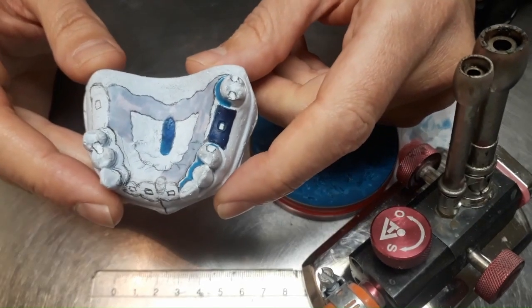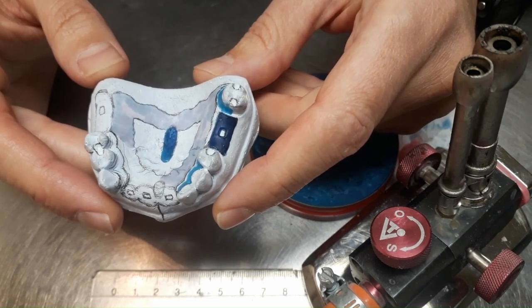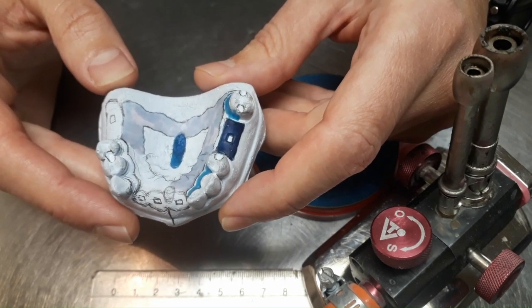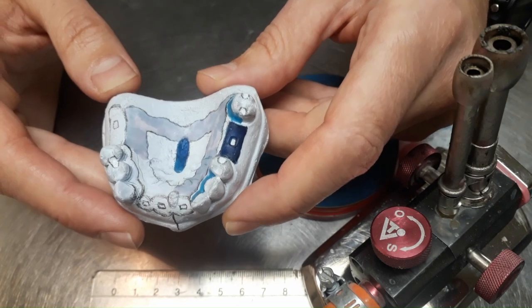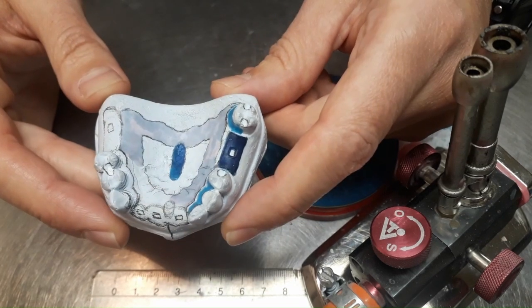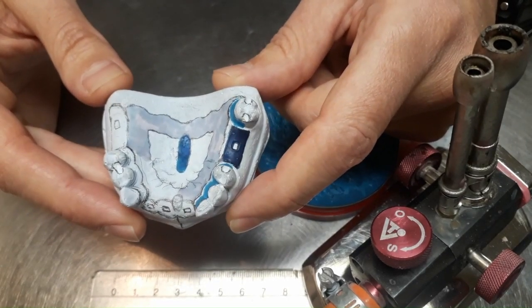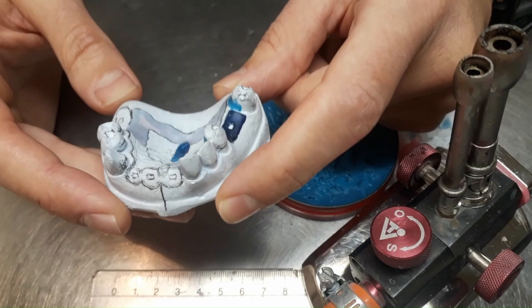The model is similar to the one that we have seen in partial acrylic denture. That's a third-class plaster. And we produce it in the same way: alginate in standard tray, and then on the model developed from this one, we make the individual tray, and then individual tray and silicone, take impression of the clinical case and get the working model or the working cast, which we have here in front of us. So we see that I needed to place some markings, to draw some markings on the model.